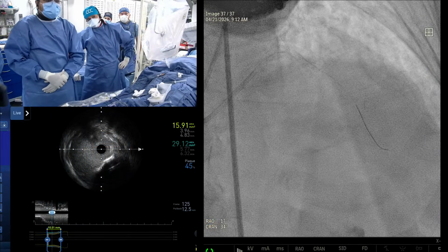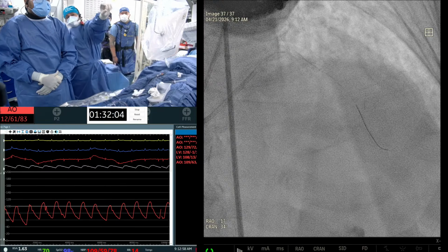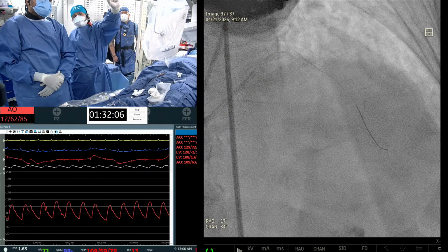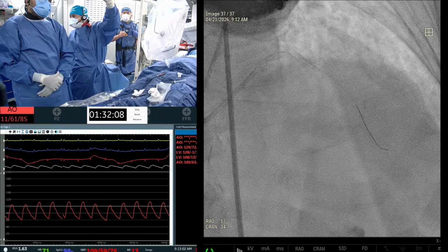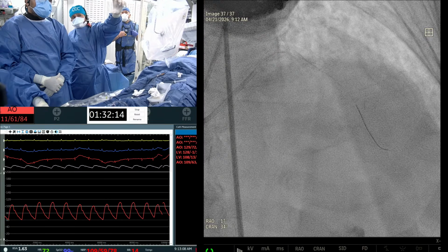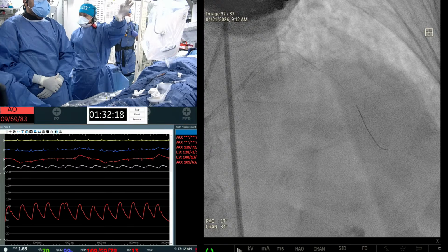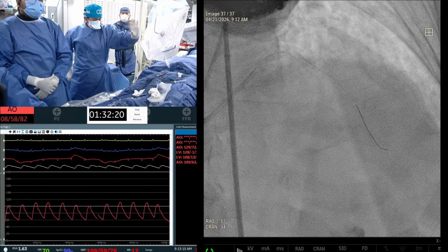Looks very good. Go back to the angiogram and hemodynamics, and we complete the presentation now. Beautiful. Outstanding. No EKG changes. So one millimeter of the strut is sticking out, which is ideal because we have to cover it. But then at the ostium, you see that it's fully apposed. Stent is fully apposed, right? Okay, good.